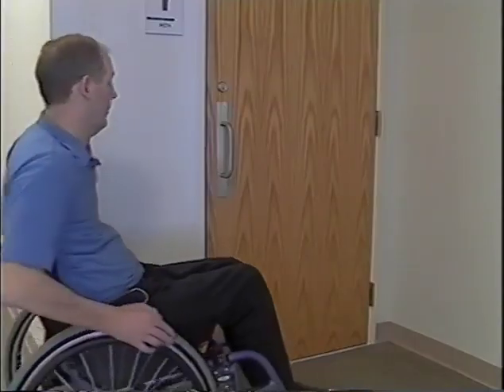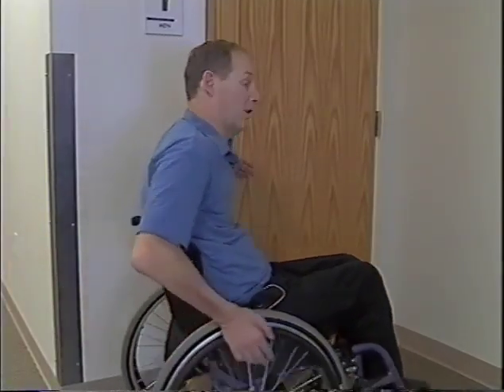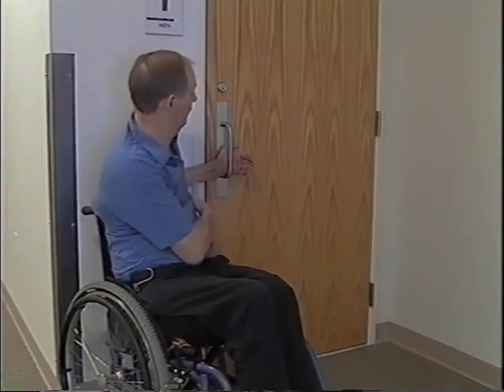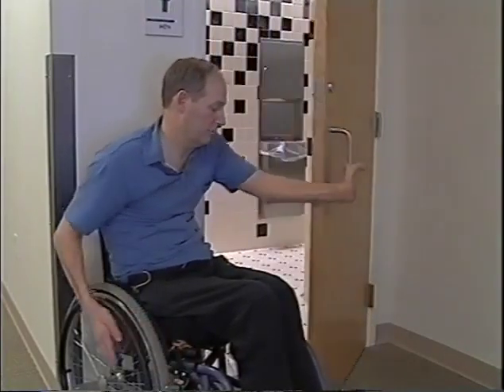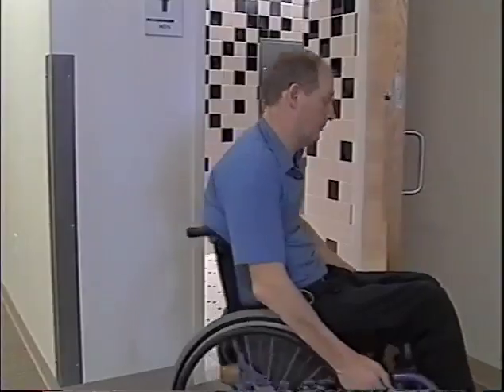And what I usually do is roll up and leave about 18 inches. And the reason for this 18 inches is you want to have a radius to get in here. So if you put your hand in the door and then start turning backwards, you're going to have a 24-inch wheel, so half of that diameter is 12. And you want to leave about 6 inches space between you and the door. So if you start at about 18 inches out, you're going to end up 6 inches away from the door. And this gives you enough room to clear the door, to clear your chair with the door rather, and be able to push it open.